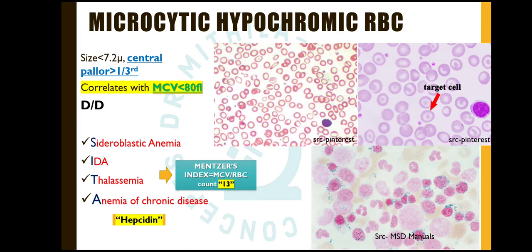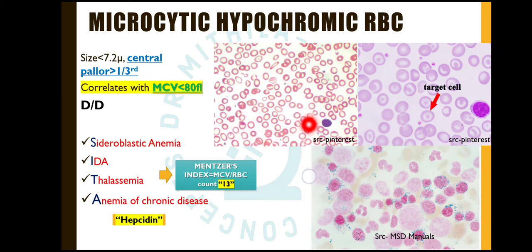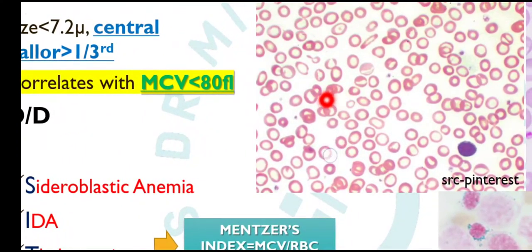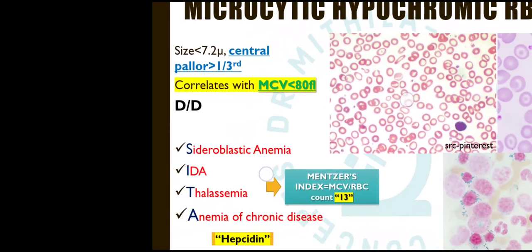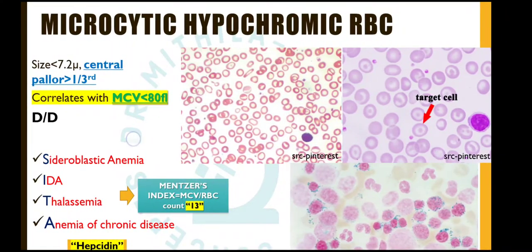Next we come to the first variation of normal RBC: microcytic hypochromic RBC. The size of the RBC becomes less than normal. We determine this by comparing it with the nucleus of the small lymphocyte — it will be lesser in size. These are the microcytes — small-sized RBCs. Hypochromia means central pallor more than one third of the cell diameter. A microcytic cell corresponds with a mean corpuscular volume (MCV) of less than 80 femtolitres. The normal MCV is 80 to 100 femtolitres.